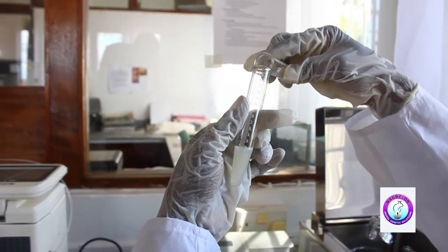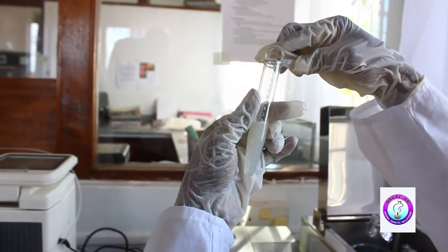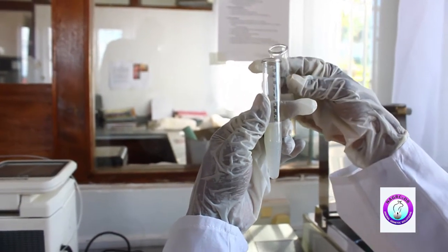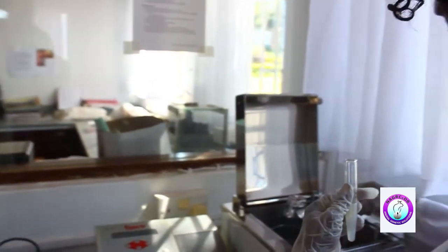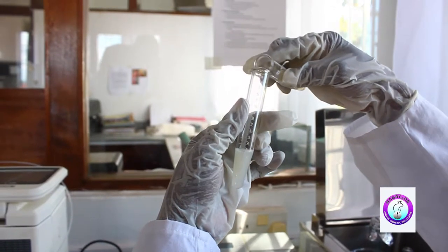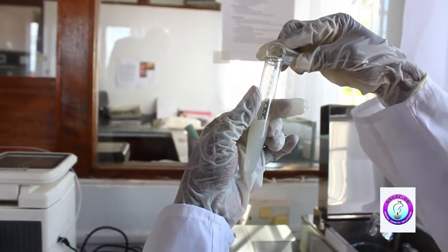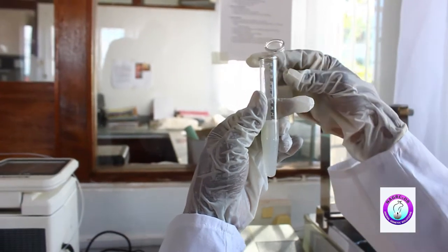If there is hair or dust, the hair can be seen through the glass, and dust can be seen deposited through the glass. That means it is dirty. But this sample we have got today is very clean. As far as I'm concerned, the color is strong enough. It shows it is heavily concentrated.